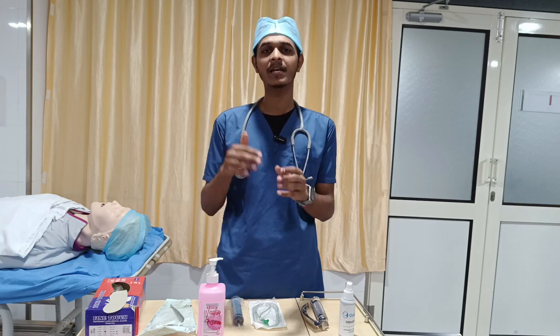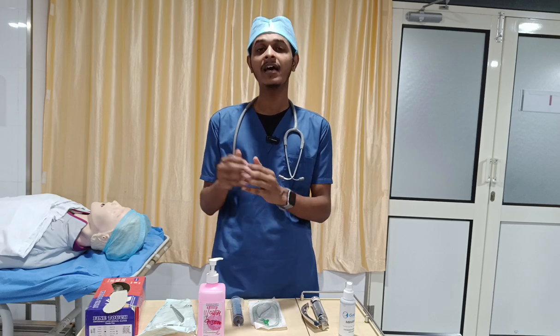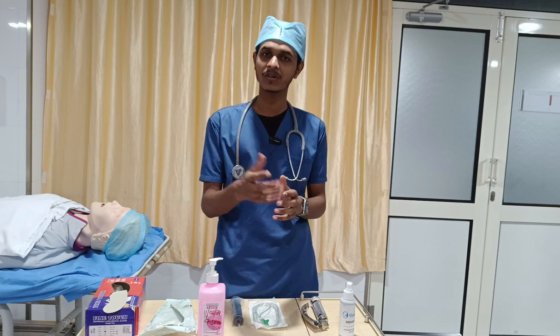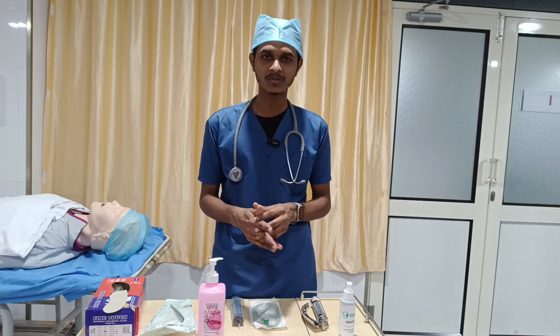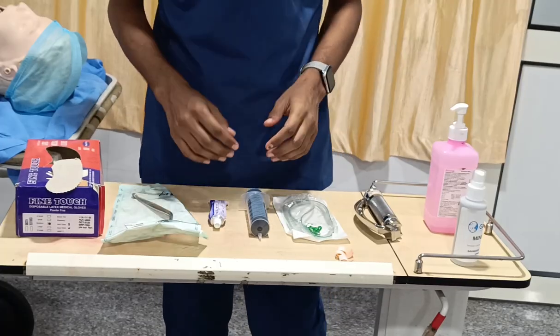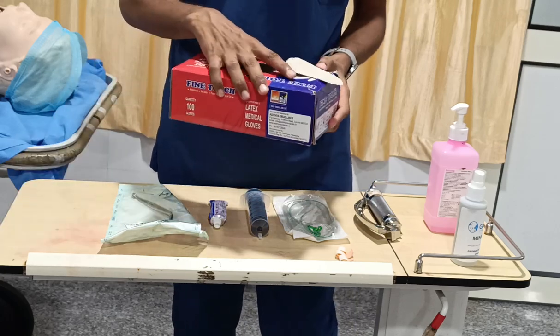So risk you have to explain, and then what are the benefits by this procedure the person will get, what are the alternative techniques we have. Those are the things you have to explain, and then you have to get into the procedure. What are the equipment or materials we need? First you are starting with your personal protective equipment.